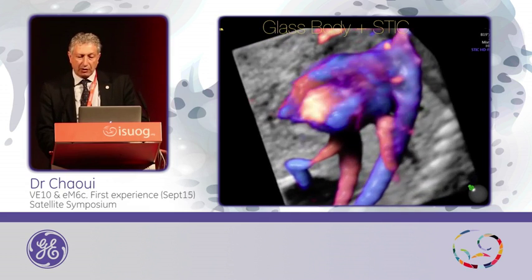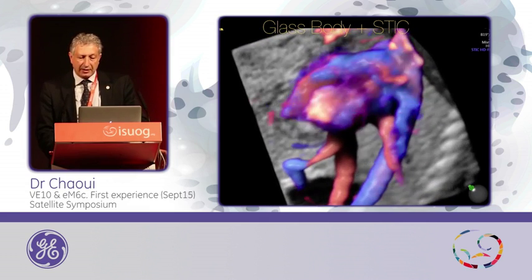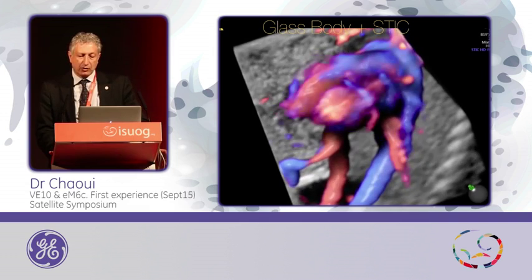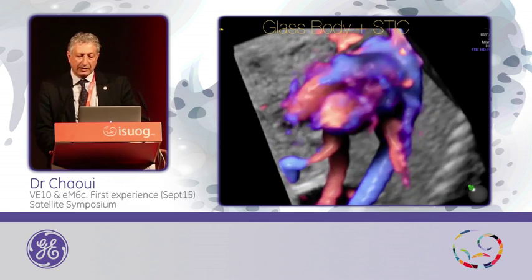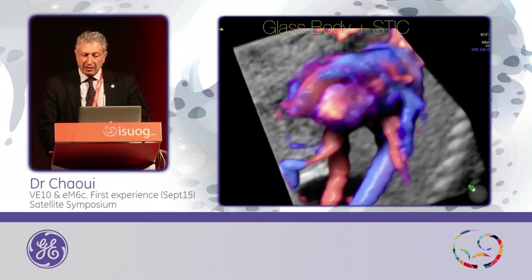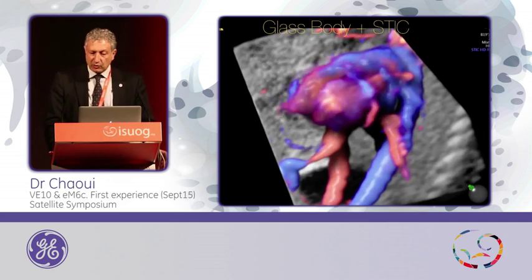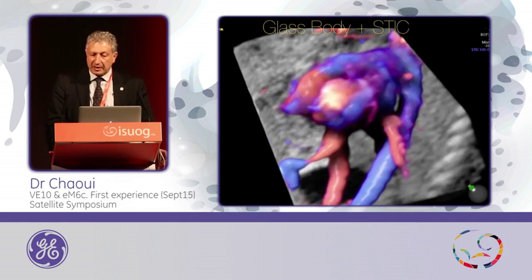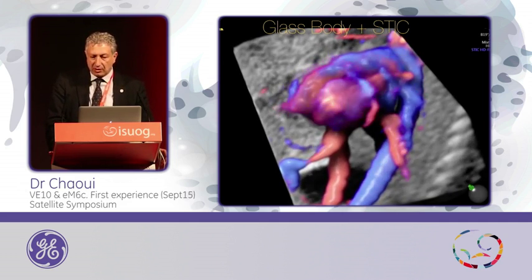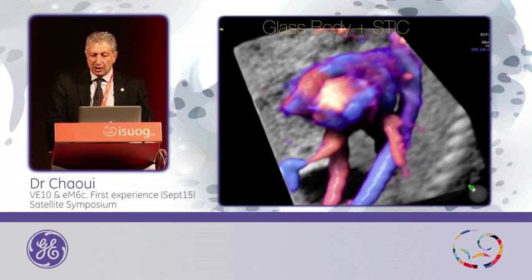And you can rotate the volume and even change the direction of light. So if you want to see the lower part, and these two pulmonary veins are not well appearing in this plane, you can rotate everything to have the best look at the heart as you want.